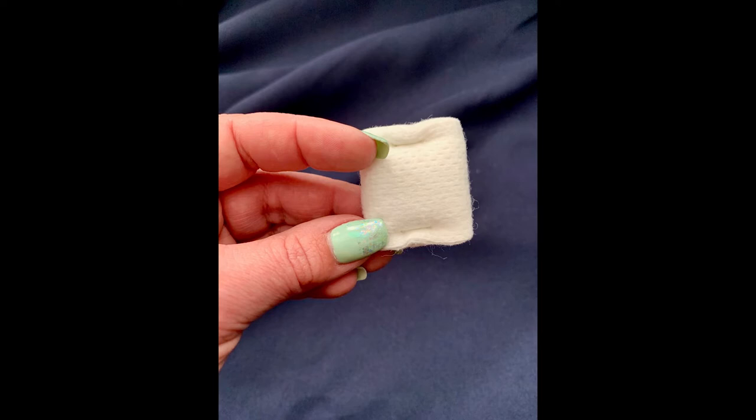Once placed, we will bump the pad, pull the sheath, ensuring that blood has come in contact with the pad, and as per our IFU, we will hold 5 minutes of pressure. Pressure should be firm but non-occlusive. One study by Dr. Trabatoni supports a manual hold time of 8 minutes. During this, they were able to achieve 100% hemostasis.